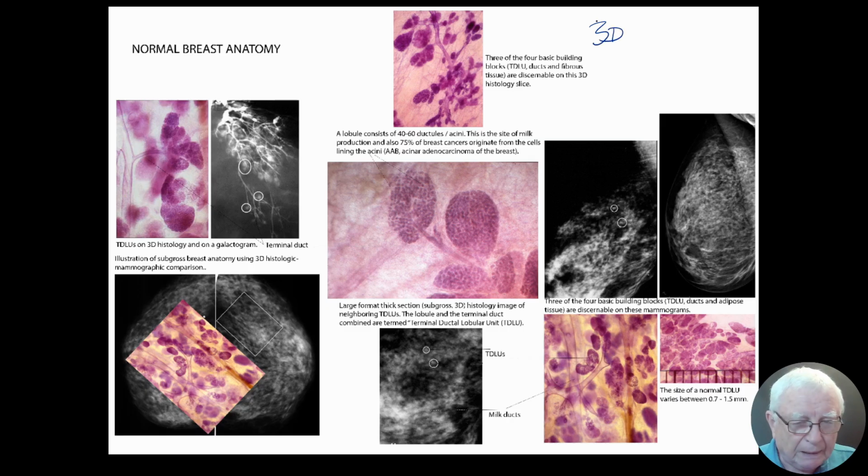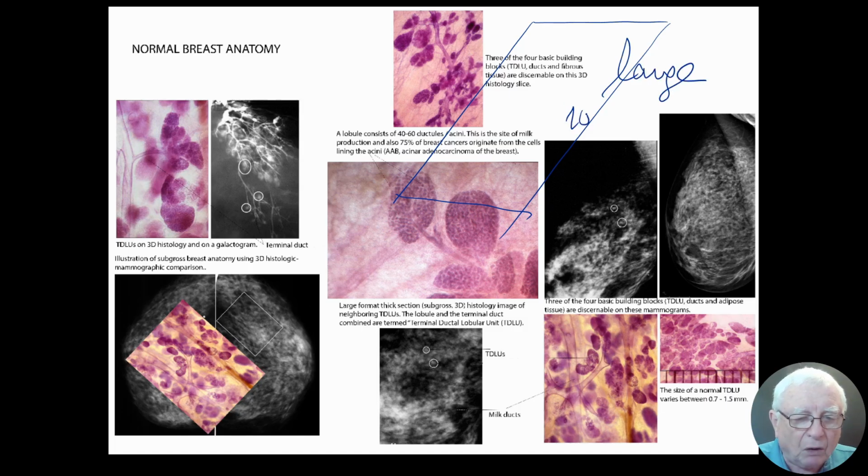What does that mean? Your pathologists are using the so-called small section histopathology slides. Unfortunately, this is outdated. What I'm going to show you and entertain you with also in real time is the large section histology. Our glasses measure 10 centimeter by 8 centimeter.